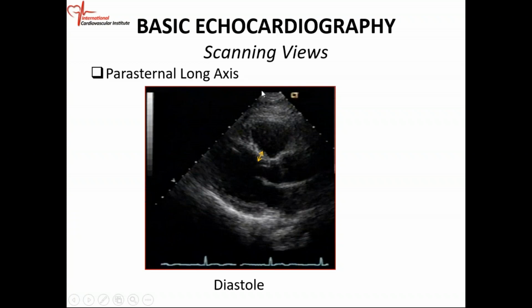In the parasternal long axis view, we measure the thickness of the septum. Again, this is a diastolic frame. The mitral valve is open, the aortic valve is closed.